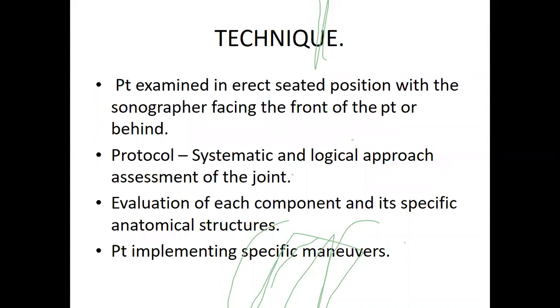The patient is examined erect. Preferably, the patient is seated on a mobile stool, or if it's on the bed, it's fine. The patient is in a seated position, with the sonographer facing the front of the patient or behind. I mentioned last time that we shouldn't be surprised when we see some protocols done with somebody scanning from behind. Whichever you are comfortable with, but I prefer to scan a patient while standing in front so that I'm able to see the patient and communicate with the patient.